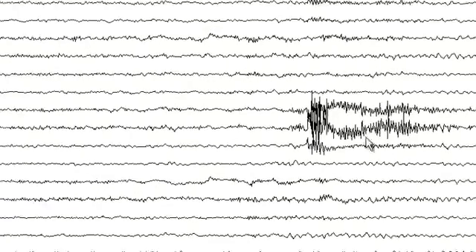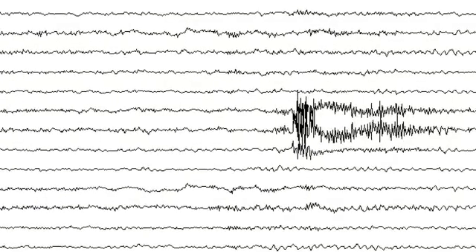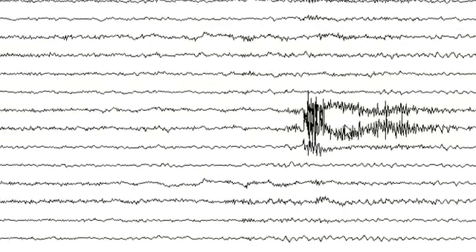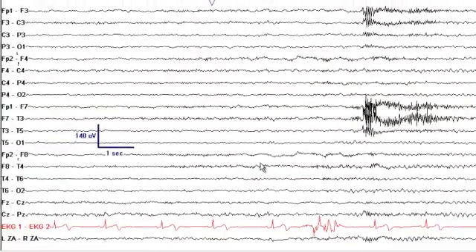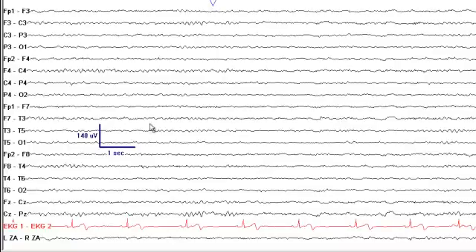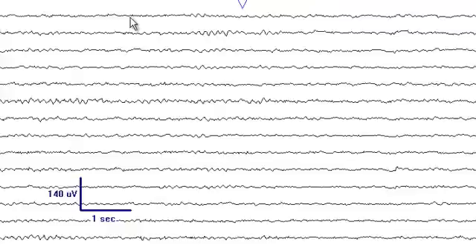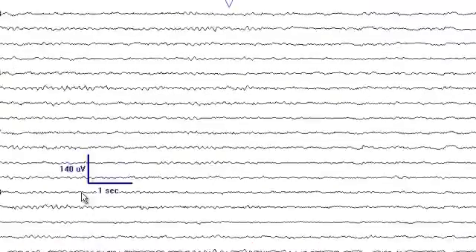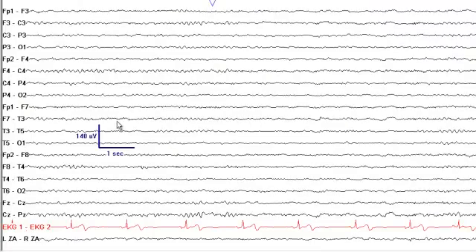There is muscle artifact in the left frontal and left temporal head region. Besides the theta frequencies, you also see beta frequencies in the frontal head region, in fact distributed throughout the whole hemisphere. These fast frequencies are beta frequencies.